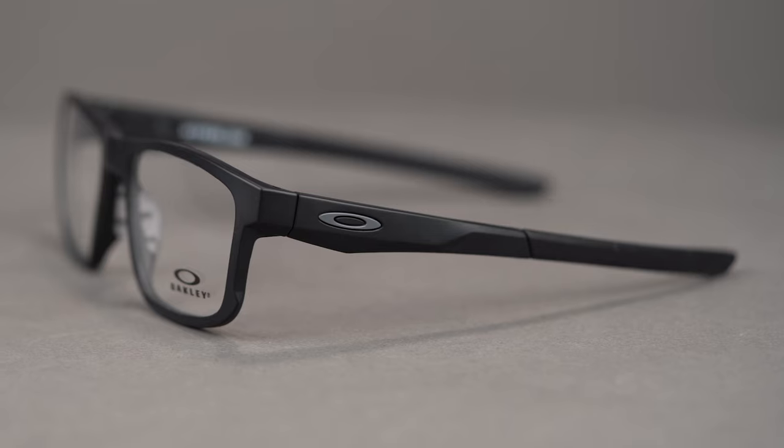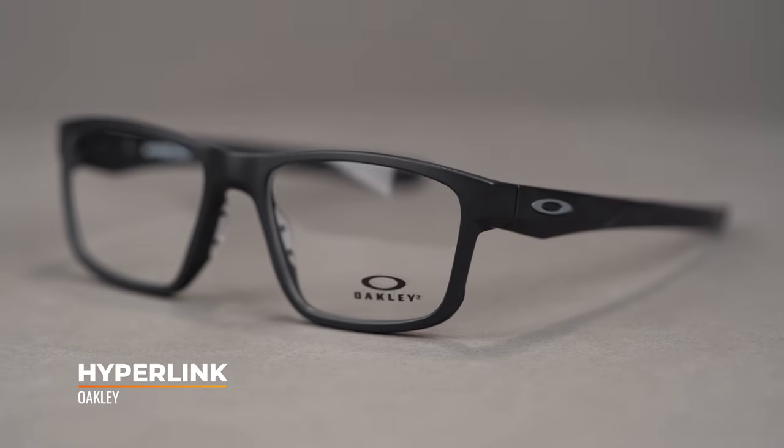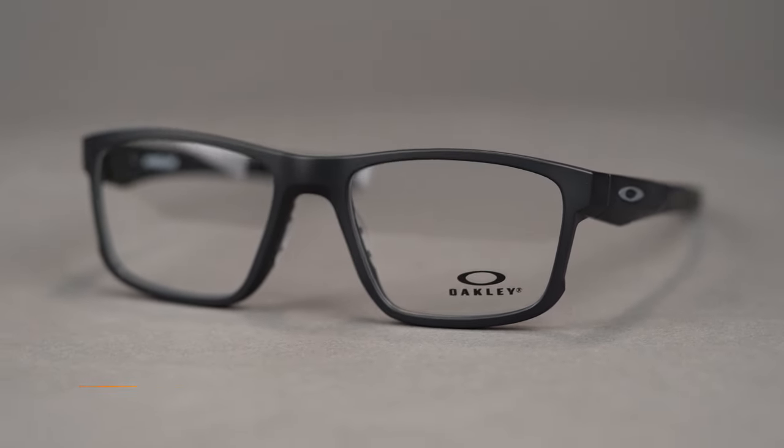Hi there, I'm Tyler, the senior optician here at SportRx, and right now we're going to check out the Oakley Hyperlink. This everyday eyeglass blends comfort with functionality. It is available in two eye sizes, 52 and 54, and has a SportRx frame width of 130 or 134 respectively, which covers sizes from a men's smaller medium or a women's medium or large.